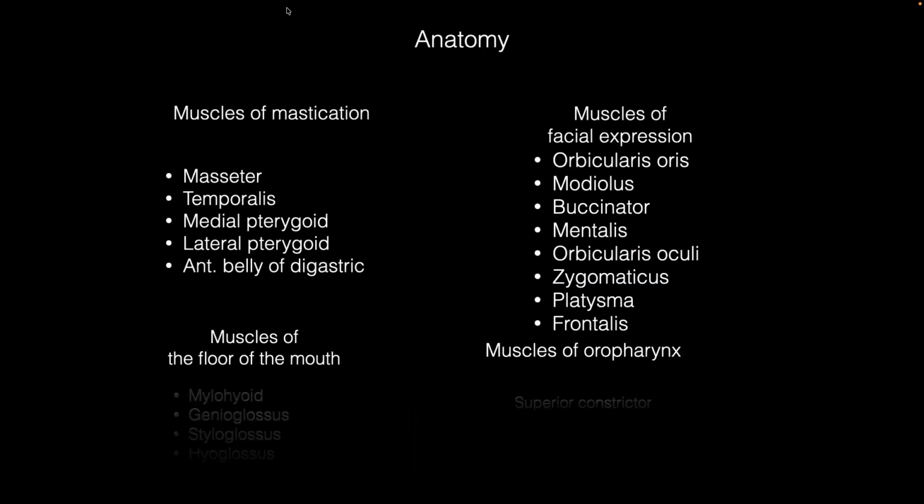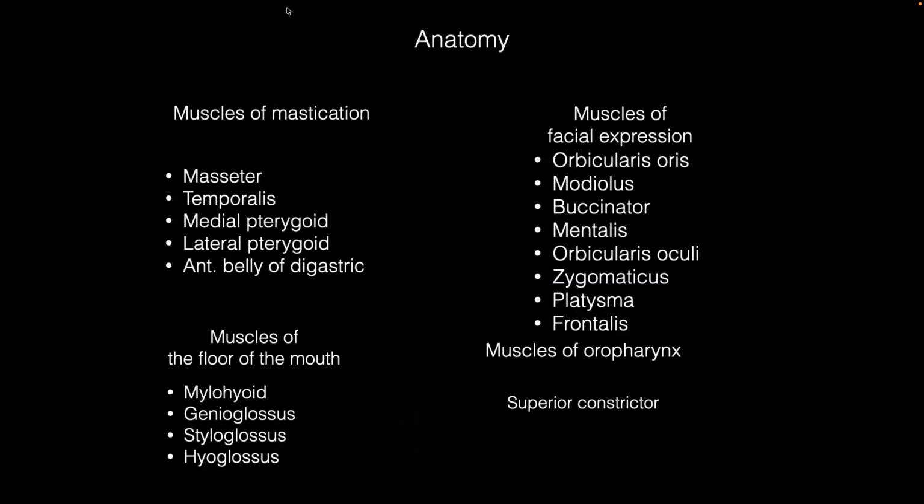All right, so it's not only pressing on the compressible mucosa to create the border seal, but there are other anatomical elements that operate in those areas near the borders of our dentures. And our denture actually interacts with those elements. If the denture does not respect those elements and their area of interaction, then they can compromise the border seal or they can create sore spots.